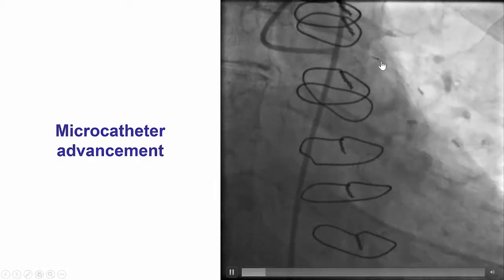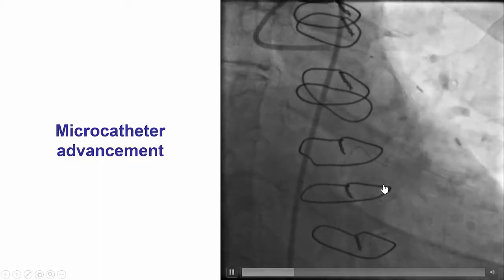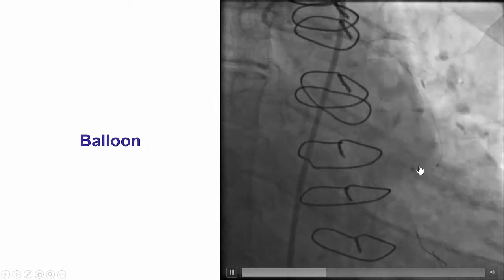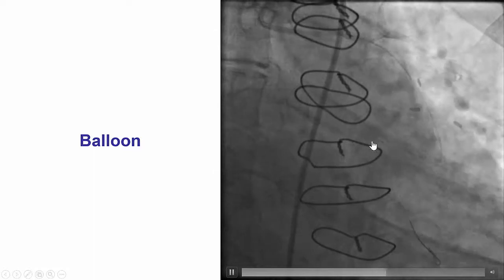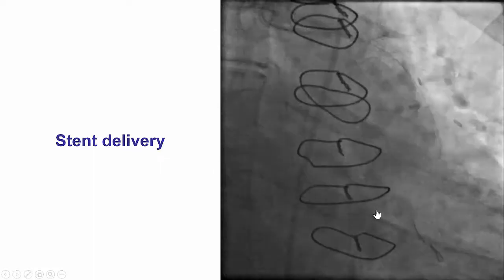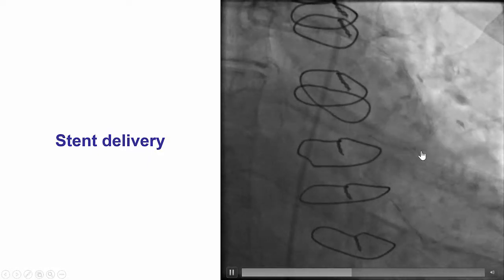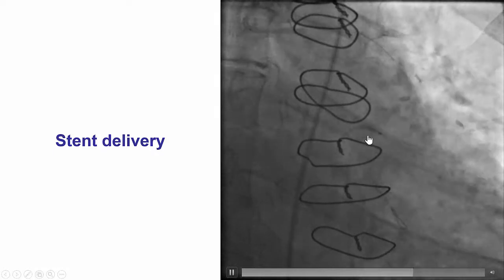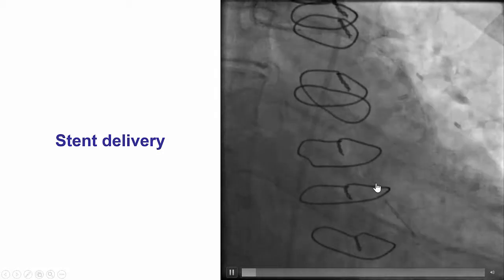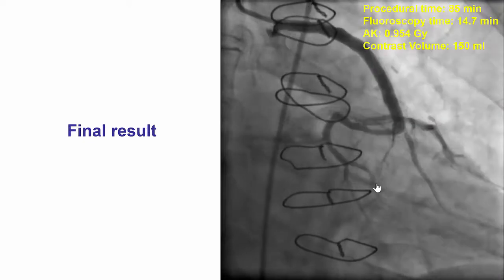In this particular case, we were able to easily advance a microcatheter — a Micro-14 microcatheter — into the proximal circumflex. We did not have this interaction with the stent, so the balloon easily crossed into the circumflex. We were then able to deliver a stent, again without any difficulty, through the first bend at the anastomosis of the graft and then through the second bend between the proximal circumflex into the target lesion. The stent was successfully deployed with an excellent final result.